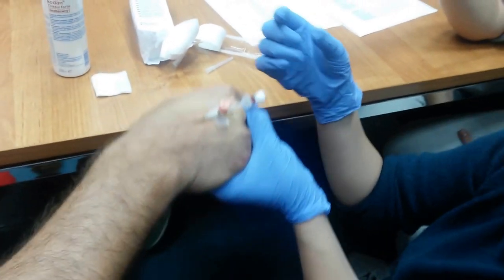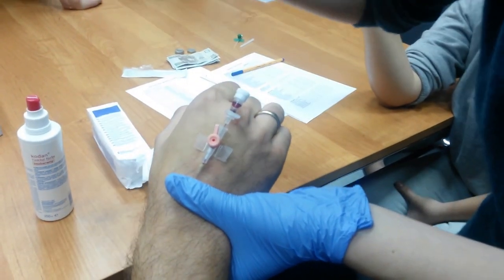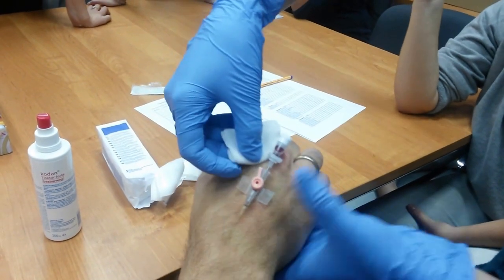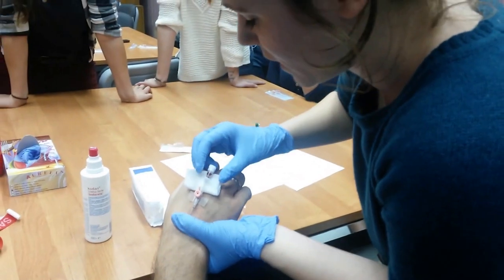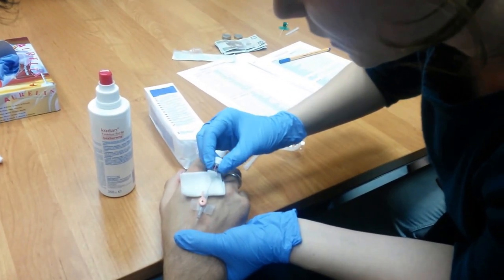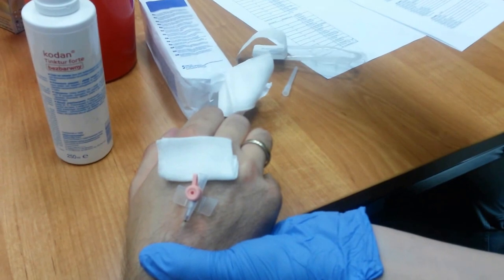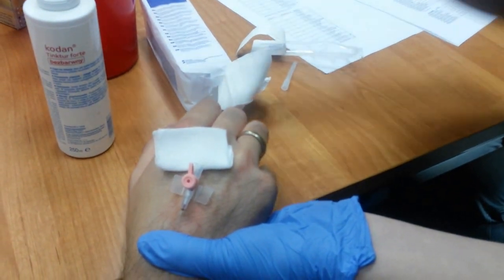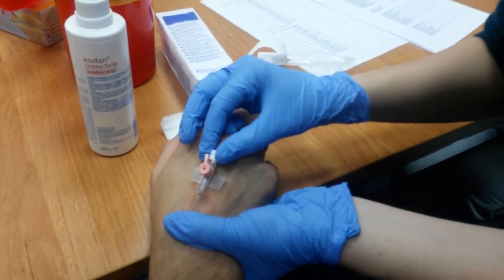I probably should have done that before. What people do is put a little swab underneath it to prevent a bloody mess. Sorry about that — just put your hand down. Clip, clip, clip — this is when it goes well, even though my hands are shaking a bit. Now give me the proper tape; there are certain tapes that you put on to secure it.